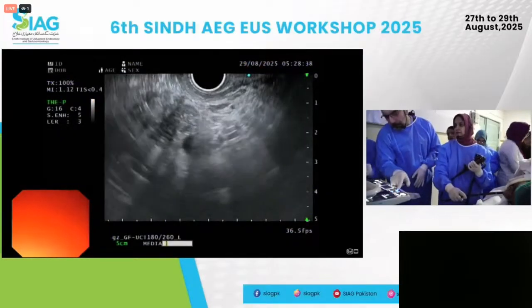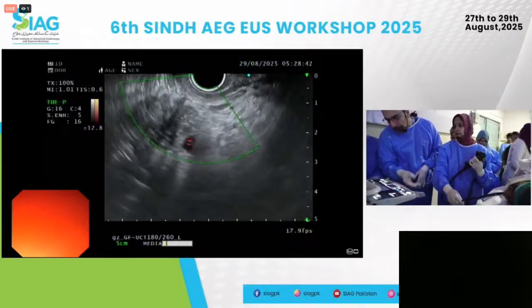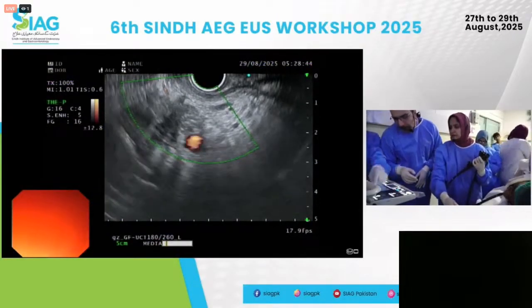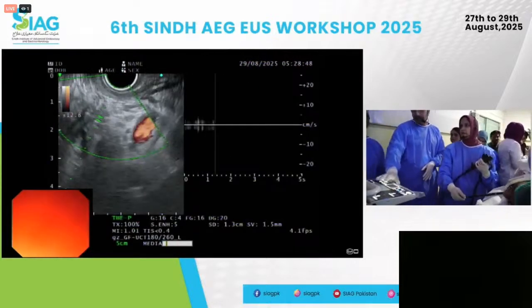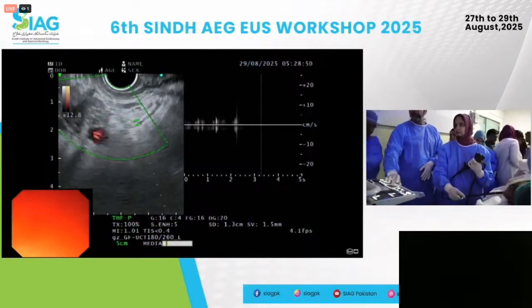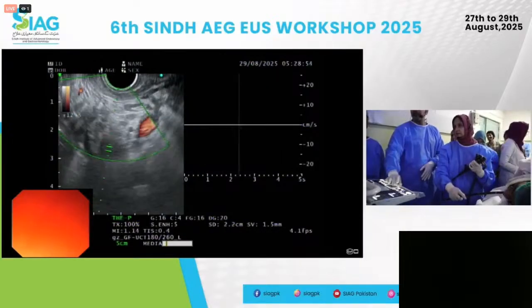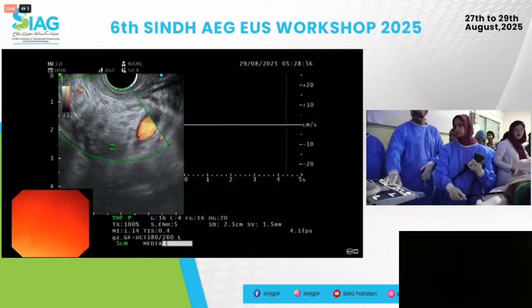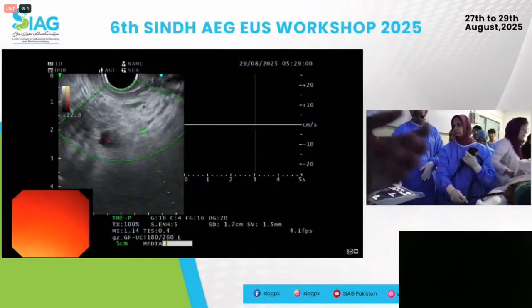Turn that on, and I want the waveform. B mode. Pulse wave. There you go. What you can do is if you suspect a vessel to be a varix, you could put this on and see. So it's a moving target. Stay in one place. Try not to move this, because if you move the scope, then I can't measure it.